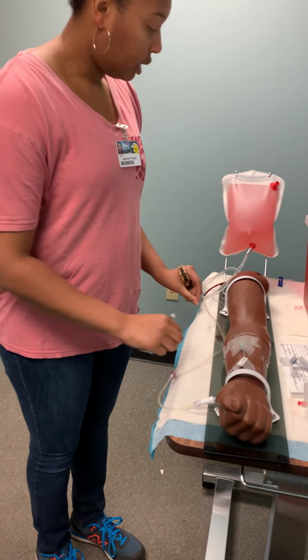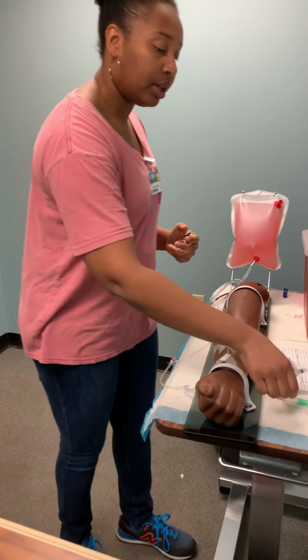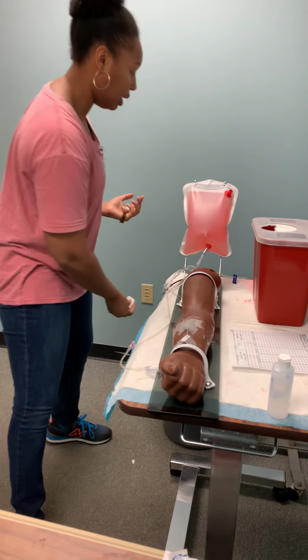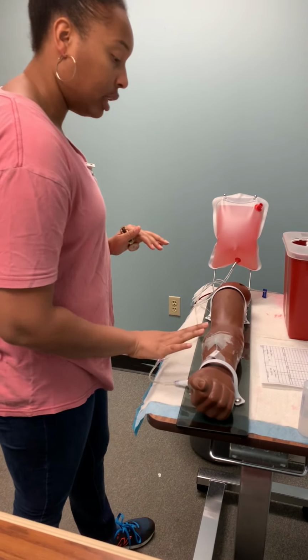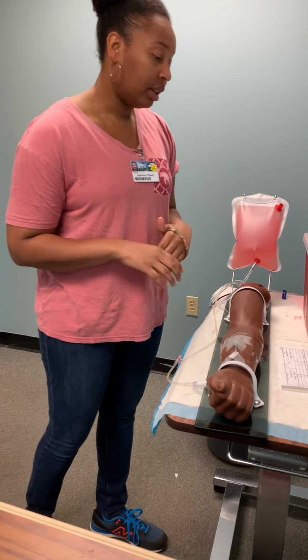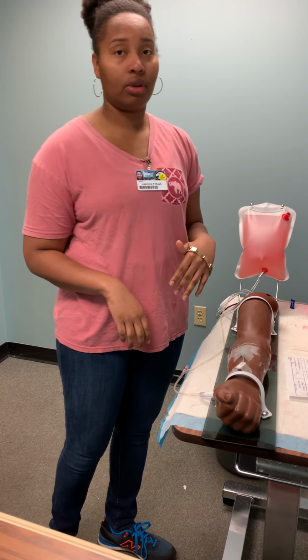I remind my patient not to get up without calling me first, because this medication will drop her blood pressure and make her dizzy. She will fall and hurt herself. I'm disposing my equipment, checking to see if there's any redness, inflammation, any swelling, asking the patient, is she okay? And if the patient is okay, the bed is in its lowest position, and make sure she has her skid-free socks on. Thank you.